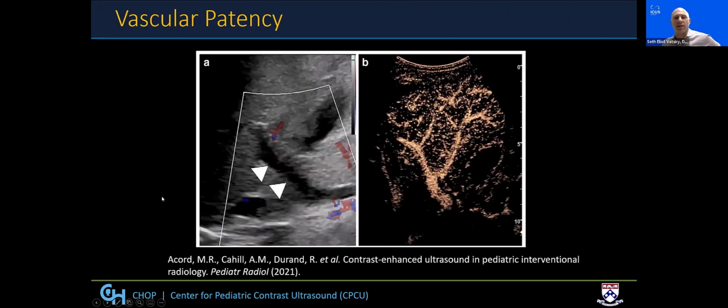My anesthesia colleagues have a saying: sometimes the best anesthesia is no anesthesia. This is also true for pediatric IR interventions. This was a 5-year-old female who presented in acute liver failure prompting hepatic ultrasound. The Doppler ultrasound showed no flow within the portal vein, and the IR department was consulted for possible thrombectomy of the portal vein. We were a little bit quizzical on this, so we did a contrast-enhanced ultrasound at the bedside, and the portal vein did enhance, excluding portal vein thrombosis and avoiding an unnecessary transport and intervention for this patient.